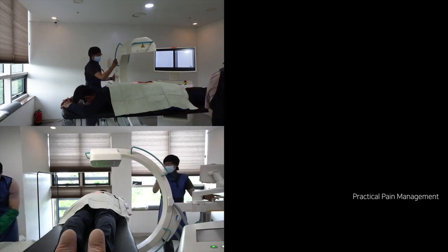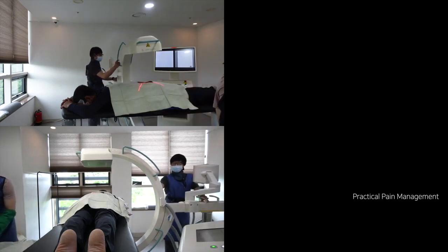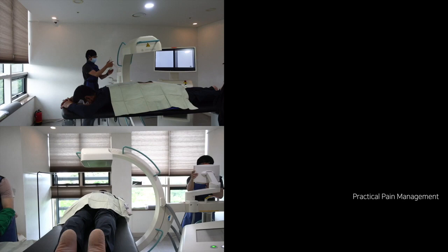It is one of the videos that show how much rotation and tilting I need to find a target and approach the needle. Please check the cranial tilting and rotation angle in each procedure. I will show you a bilateral L5 transforaminal injection with the help of a contralateral oblique image. The patient underwent an operation of interlaminar fixation devices at L3-4 and L4-5 levels.